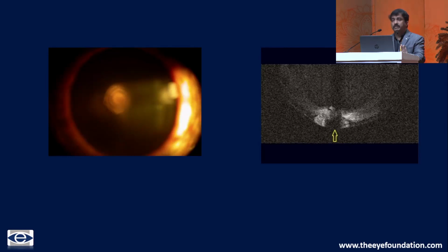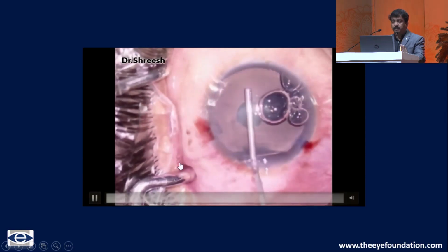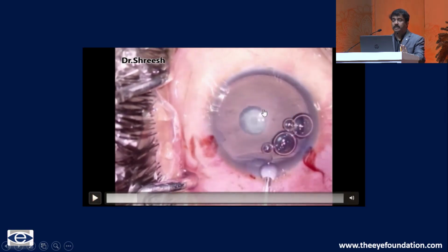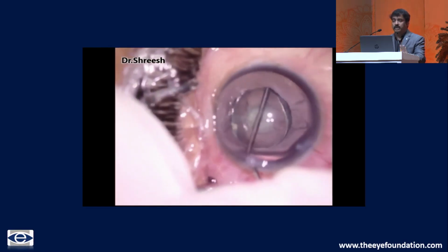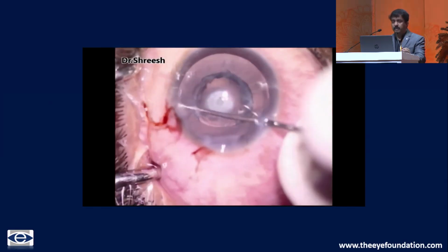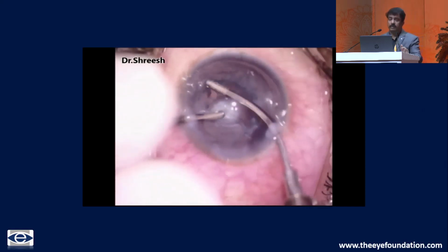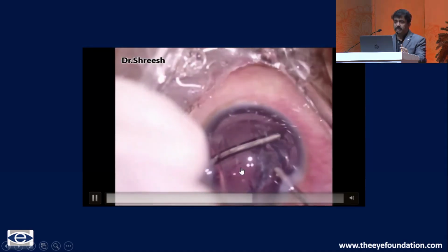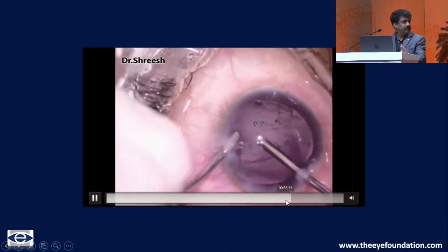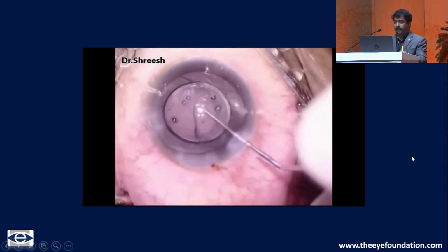Another case of posterior capsular defect. In this particular patient, when I injected visco into the anterior chamber, I could see a split happening. And this is the split that has happened during injecting of visco into the anterior chamber, and so you have a posterior capsular tear right from the beginning. So one has to be careful, and I did a mechanical delamination and layer by layer removal of the cortical material, and there is a vertical split which was extending from the limbus to the limbus, and I did the anterior vitrectomy. This is an old case, so I have not used triamcinolone here, but I could place the lens in the bag.